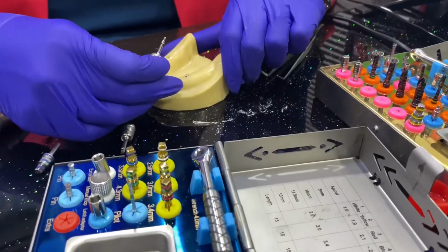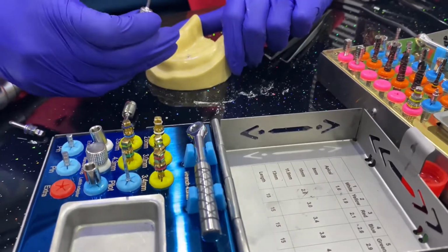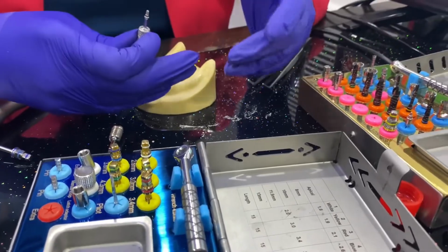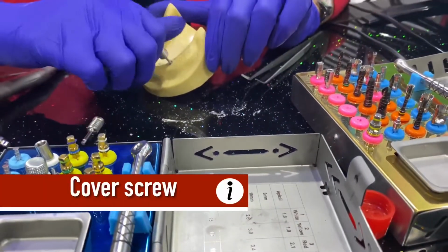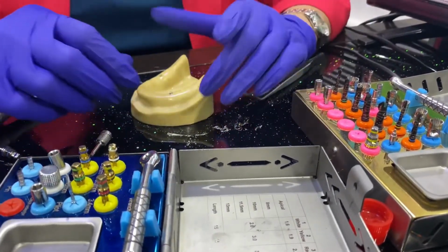At this point of time, you will repeat your X-ray to see whether the implant is in the correct position and it is not close to your mandibular nerve or any vital structures. If you're placing in the upper, it is not close to your sinus. So you will check that again before placing, and even after placing the implant, take an X-ray, and then I will be putting a cover screw, closing the site with sutures.